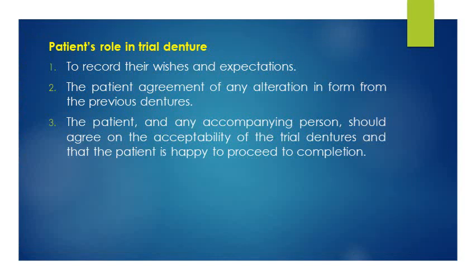The patient's role in the trial denture record. As you know, the patient should be very satisfied with the result from each step, and the patient, with his parents or any relative, should also check it for happiness and satisfaction.